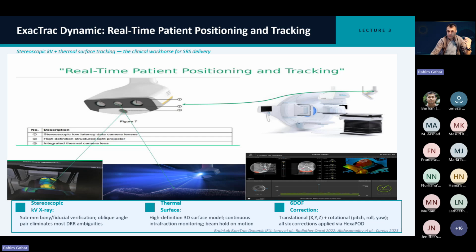And then you do the stereoscopic imaging, and you can simultaneously see if there is any minor motion of the patient. The scale is very small, so sub-millimeter. And you can define the tolerances during the preparation of the templates for head and neck, for pelvis, for every site. We have particular protocols built in. So the green tick means that the tracking is not going to stop the beam. And if it is not within the tolerance, then definitely it will stop the beam. So that's the whole thing.